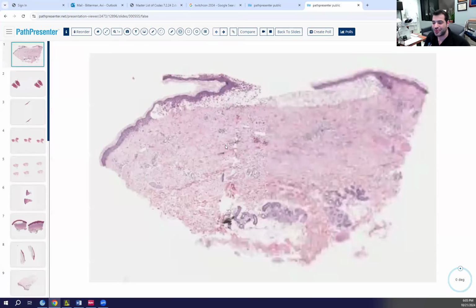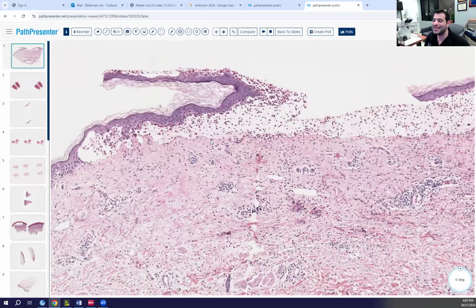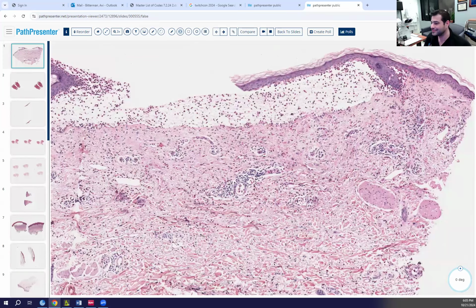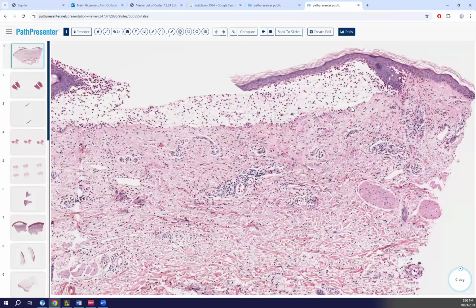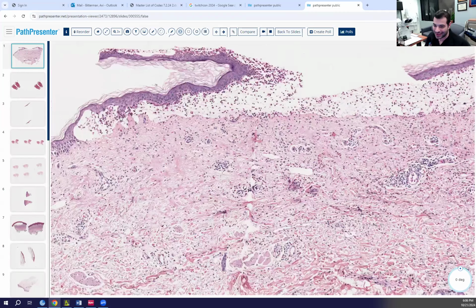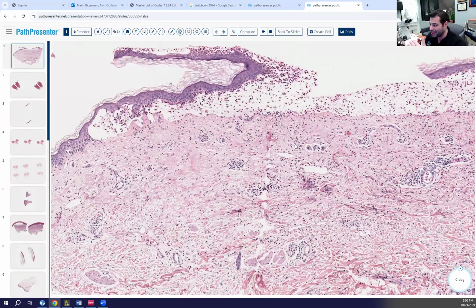And you see how this was so clean? There's a reason why. Why was this split clean? Because you get antibodies attacking the basement membrane connections of the basal layer to the basement membrane. It's the same exact cut. It's the same exact antibody targeting the same exact place throughout this entire bulla, and so it's going to split at the same place.